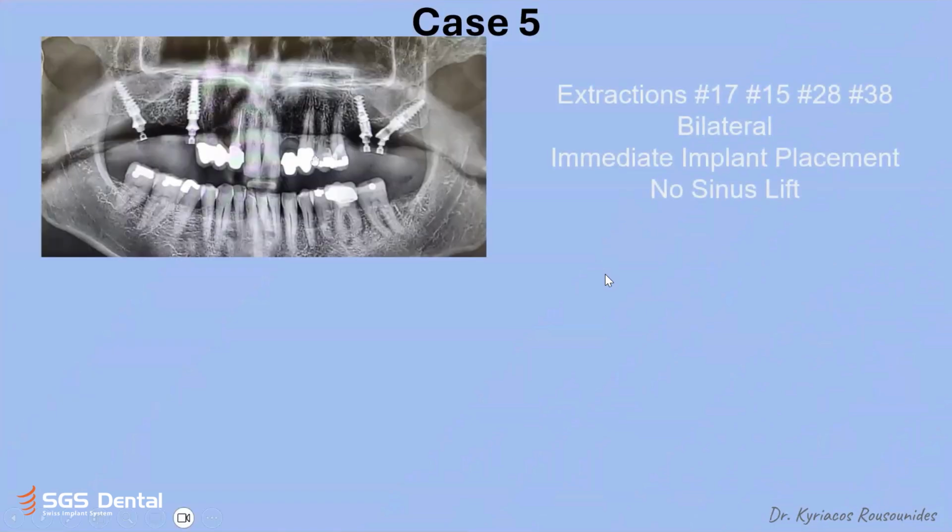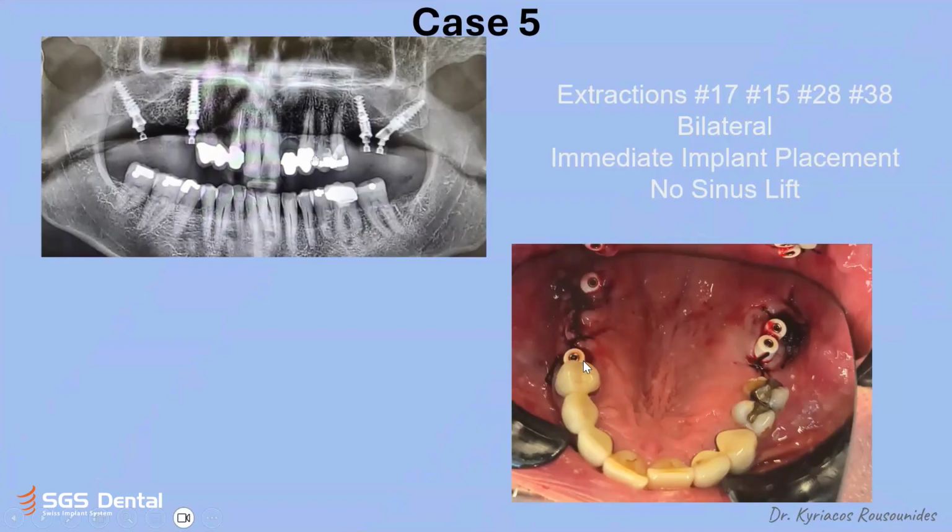And here are our results. You can see that the two abutments here are attached. We'll have a frontal cantilever, but we didn't have any other option this time. And here we'll have a normal bridge from 7, 8 to 17.